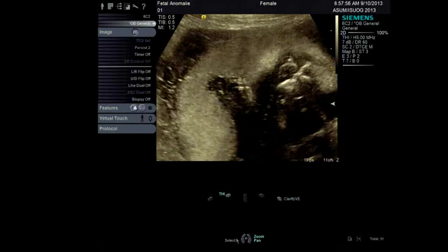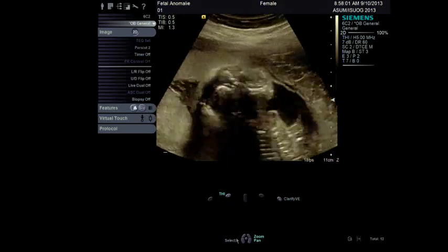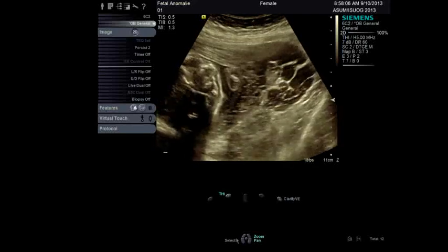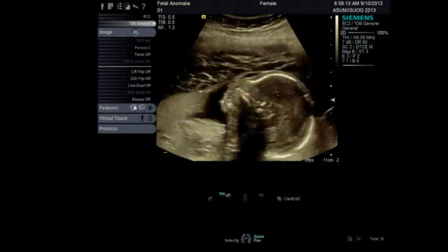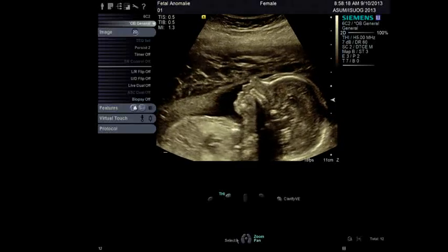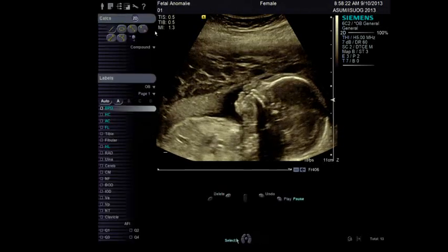Our life as fetal medicine specialists is quite easy because we don't do that much screening. We often look at specific structures rather than doing screening scans. Is there anything else that the chairs wanted us to point out particularly, or perhaps the audience wanted us to see? In fact, during one of the sessions yesterday, the topic of how to measure the fetal liver size came up. And so I'd be very interested in knowing what your technique is for measuring the liver.